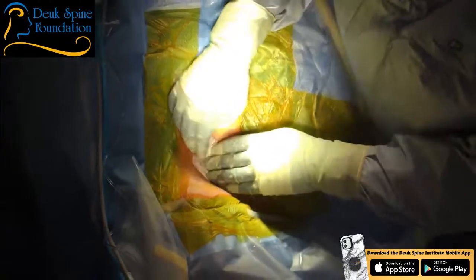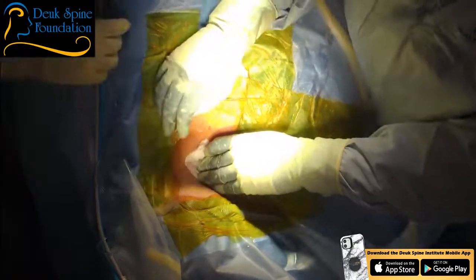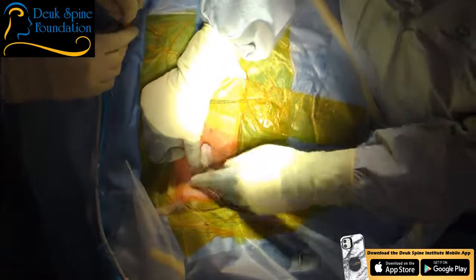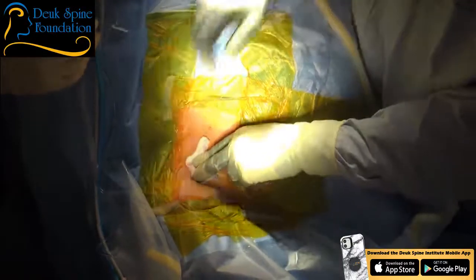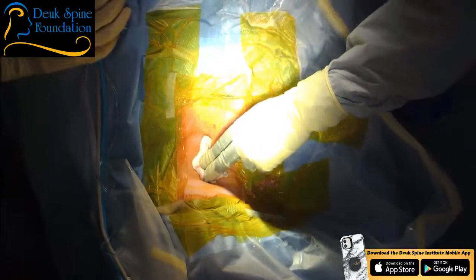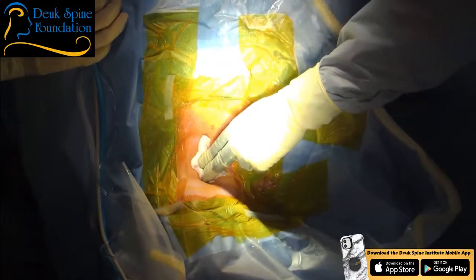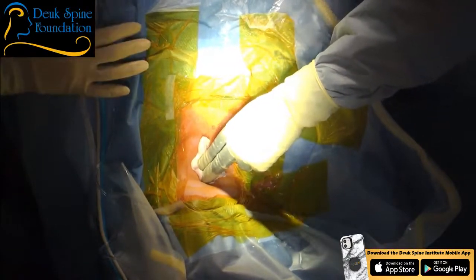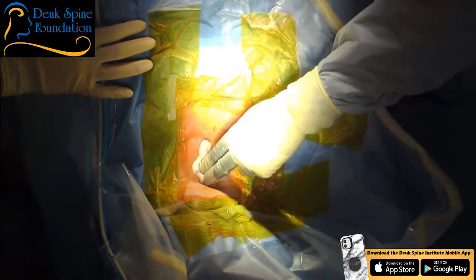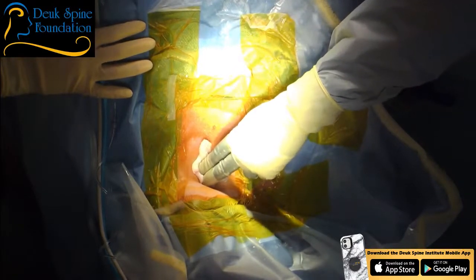I'm going to show you the incision is very small. We always apply pressure because veins can bleed. So you want to apply some pressure. Get this out of the way, please. It doesn't belong there. So we apply a little bit of pressure for the veins for about 4 minutes.